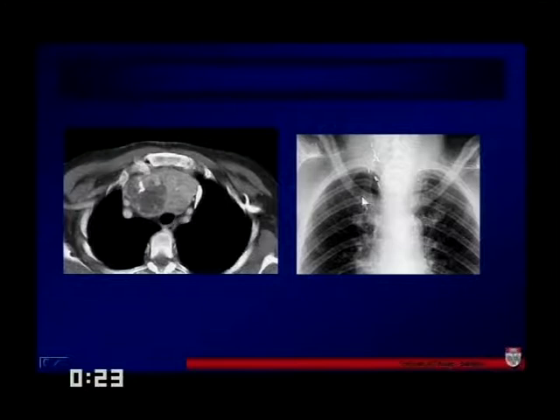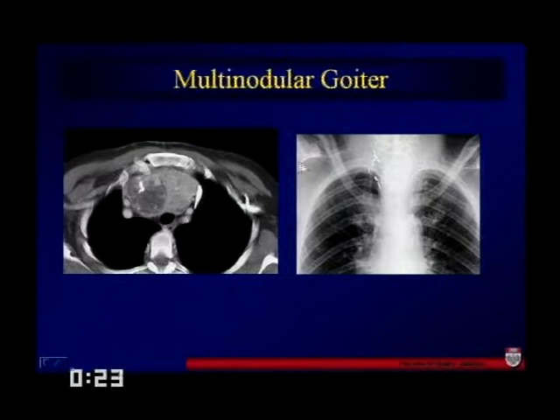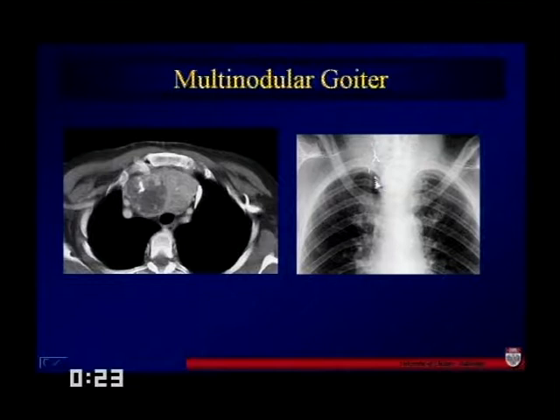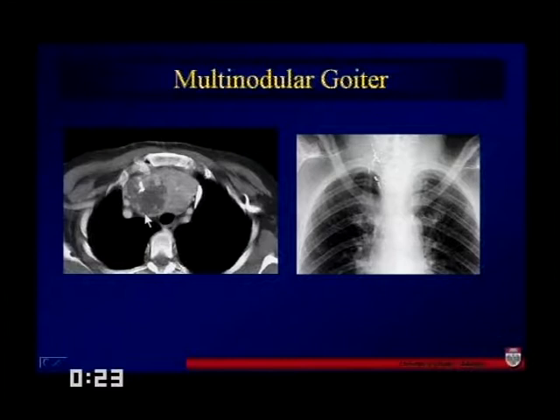This is a case of a retrosternal thyroid or multinodular goiter extending deep into the mediastinal region. On the radiograph we have resection of the right side of the thyroid already, and significant tracheal deviation from the large left-sided mass towards the right. Further down, it's inhomogeneous with a large low-density area and some calcification. We don't readily see the left innominate vein crossing in front of it — this is not only a large retrosternal goiter, but it's also causing vascular compromise.